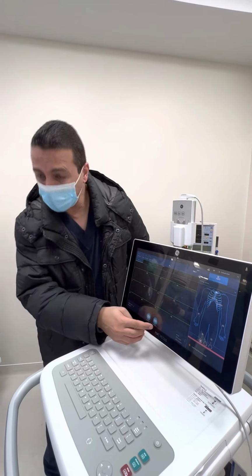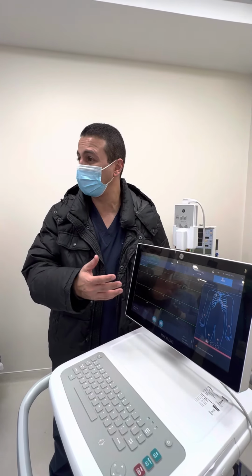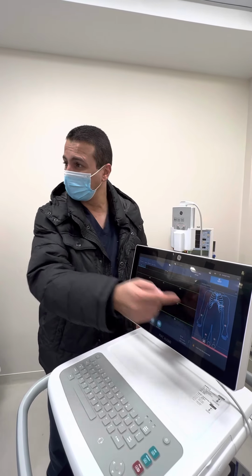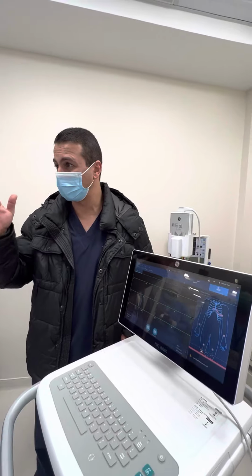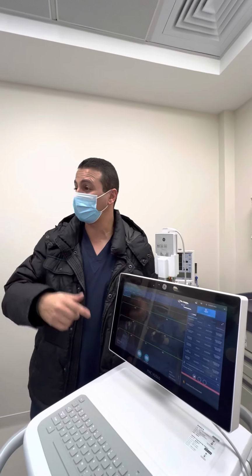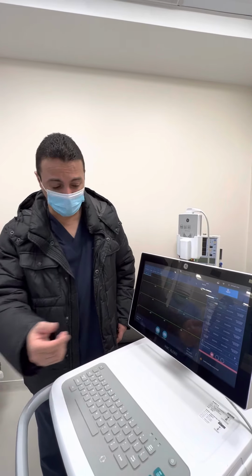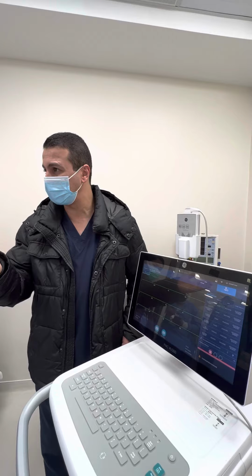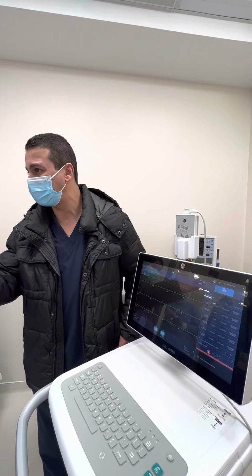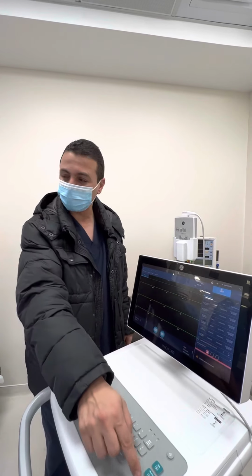So now in the rhythm reports, you can print out and you can save up to 5 minutes as well in the files. You can transmit to your patient's profile. Before we couldn't transmit in the previous machine, but this one we can do. Okay? But we didn't fix the time, as you know, in the rhythm reports because it's different from one physician to another. Someone will ask for a minute, 2 minutes, 3 minutes. So upon pressing the button here, you will start counting, then press stop.